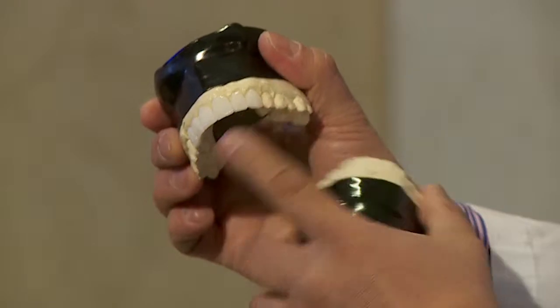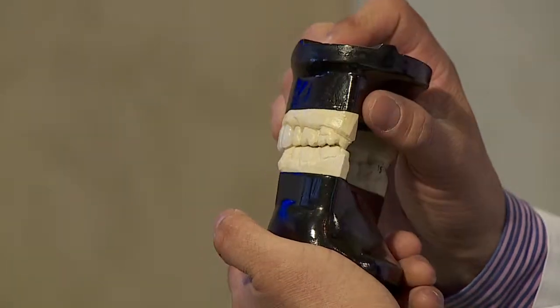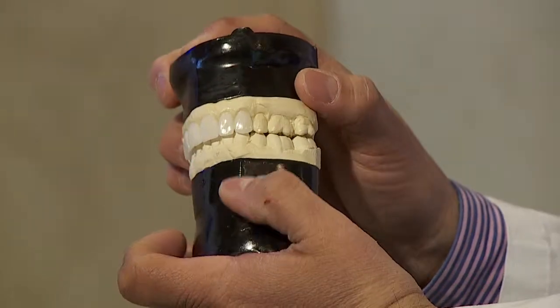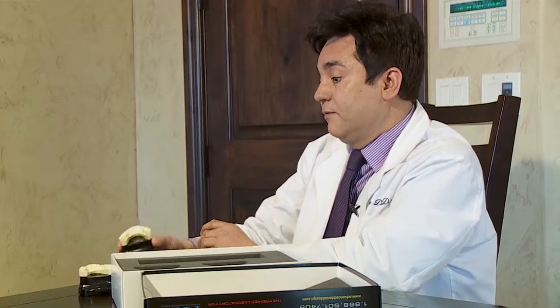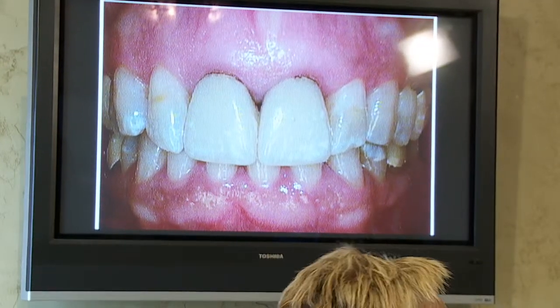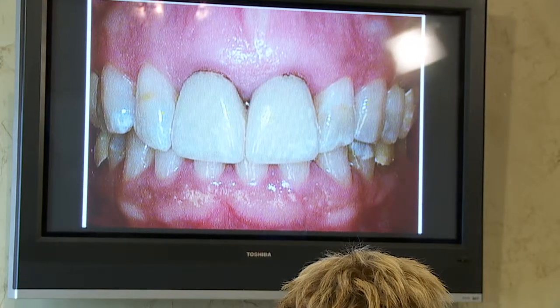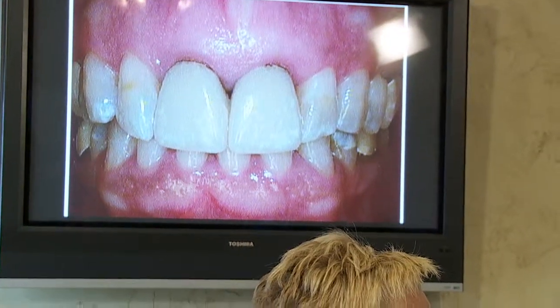This is a mock-up of your teeth, the way they will be set up today. As you can see, the profile is a lot better. Today, you will be living with a new smile. Okay. This is your smile now. The space that you have between your teeth, right there in the middle, we'll be able to close that by doing the smile lift. I love that it's called a smile lift, by the way. That makes me happy. Okay.